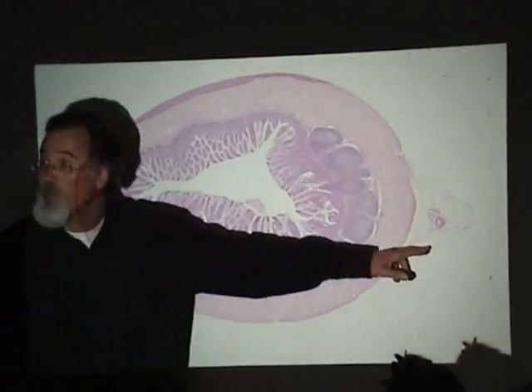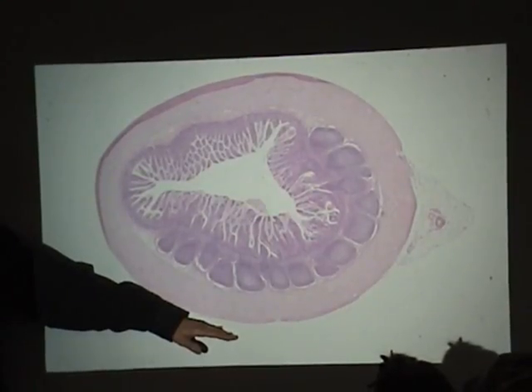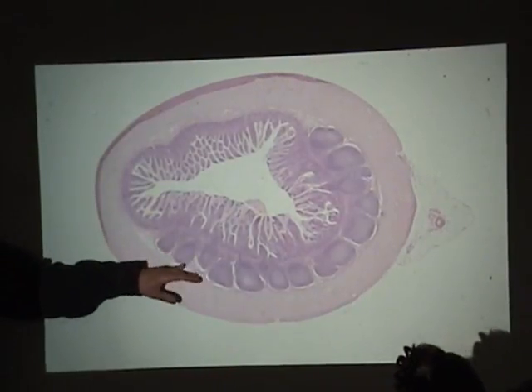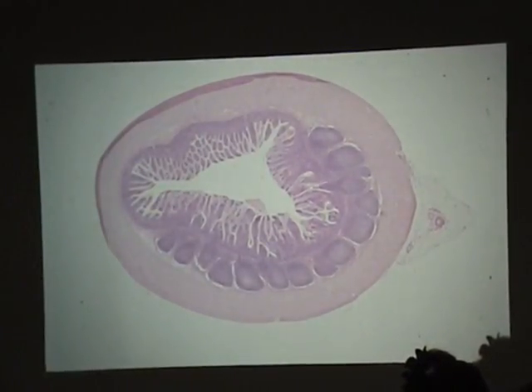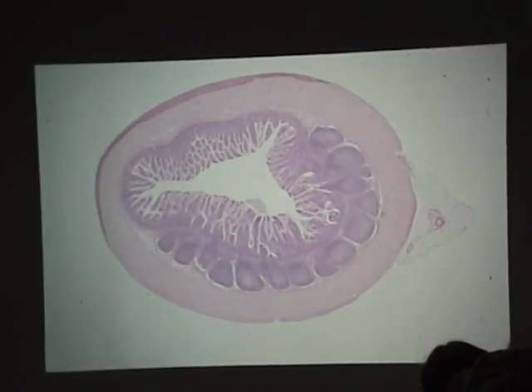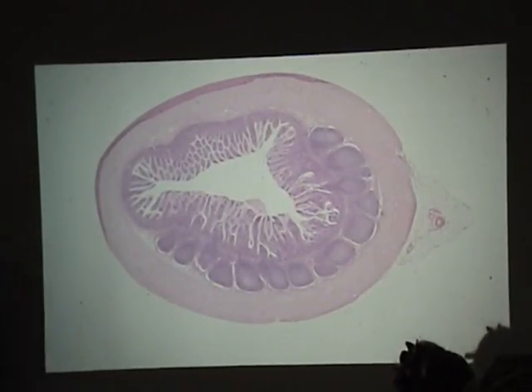Out here, there's not going to be fat. There might be a little bit of loose connective tissue, or it might just be the mesothelium right down on the longitudinally oriented muscle. Okay? So, clearly with Peyer's patch, you've got, what are there, 12, 14 nodules? Most of them have germinal centers. In the nodule, the majority lymphocyte would be B, but we're always going to have a few T helpers, to tickle them, if you will. But those T cells that aren't tickling hang out in this interfollicular area.